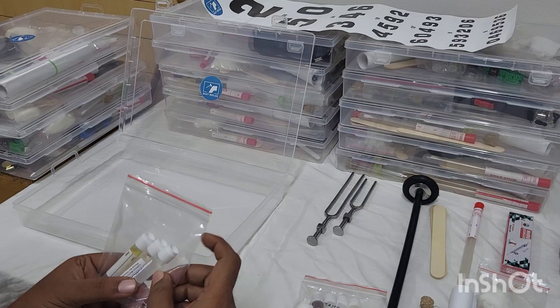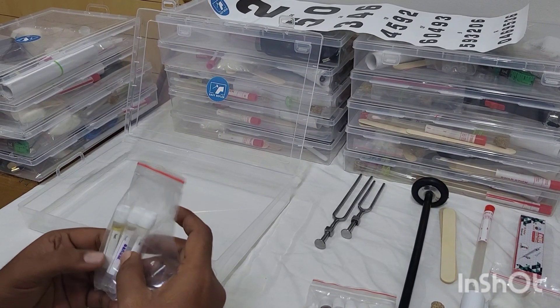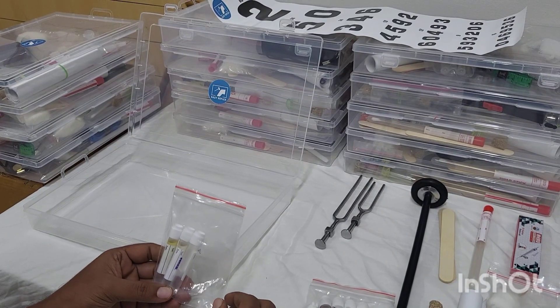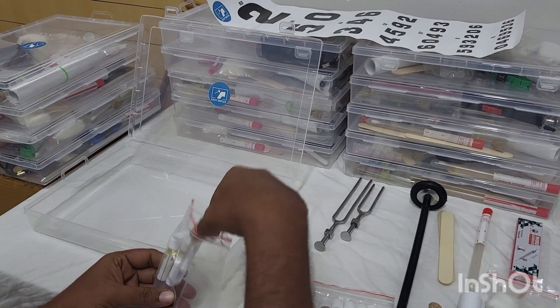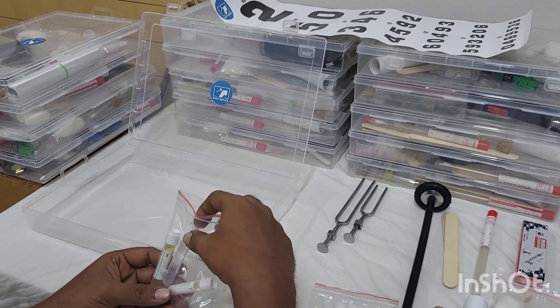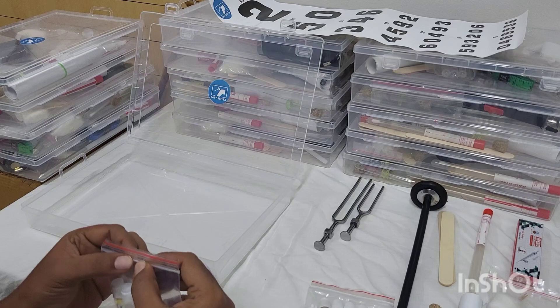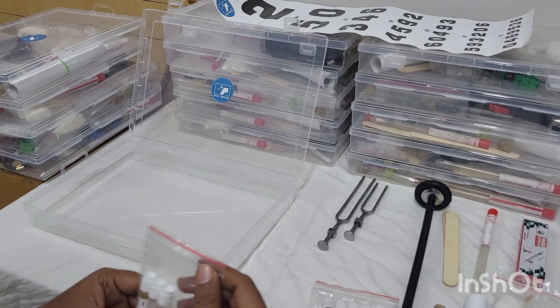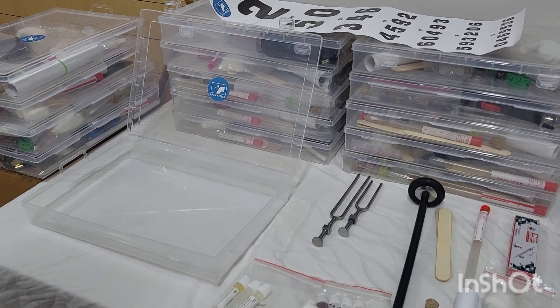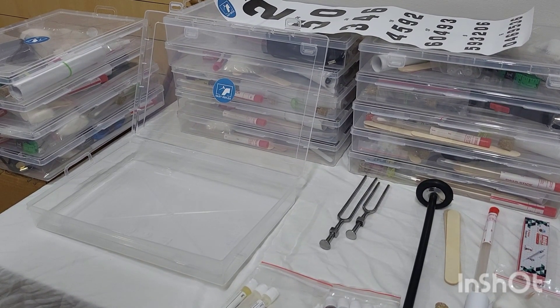First we will start with our smell pack for olfactory testing. We have given three different synthetic smells — one is coffee, another is sandal, and another is lime. Patients will not be able to identify them by color, since they are synthetic. They will last significantly for more than three years, so you don't have to replace them or spend time before exams running to the hostel mess or home looking for cooking items.